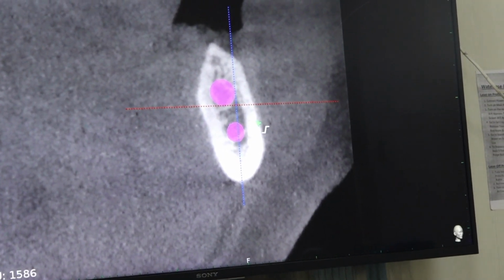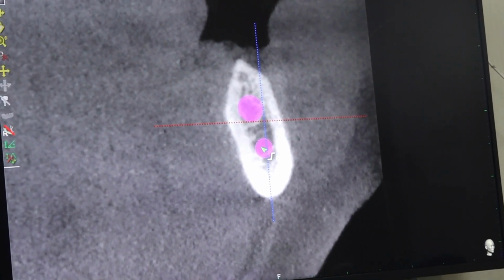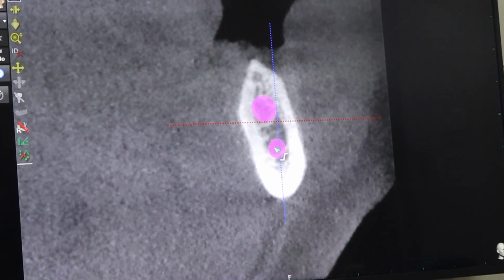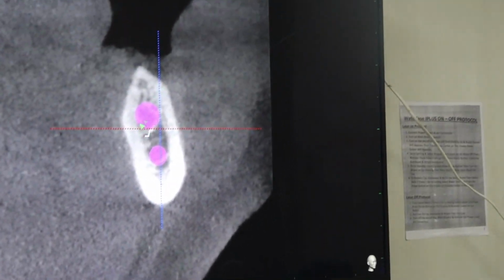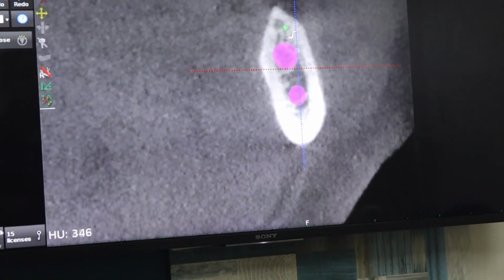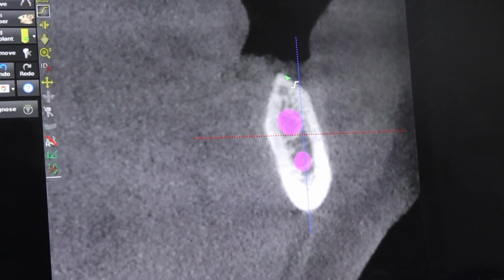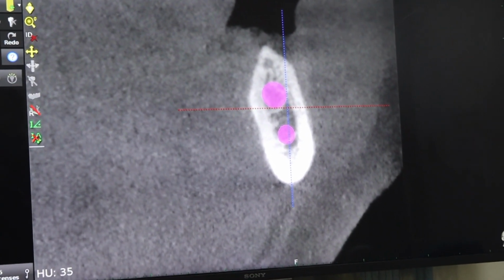As I already told, maybe the lower canal may be a real canal or a marrow space, but it doesn't matter. But the upper canal is above the mylohyoid ridge, which is very rare, right? Very rarely you see. So lingual cortical engagement is out of question. Using only the crestal bone is also not very favorable, because if you give 2 mm safety, you will get only 3 mm bone, which is not good.